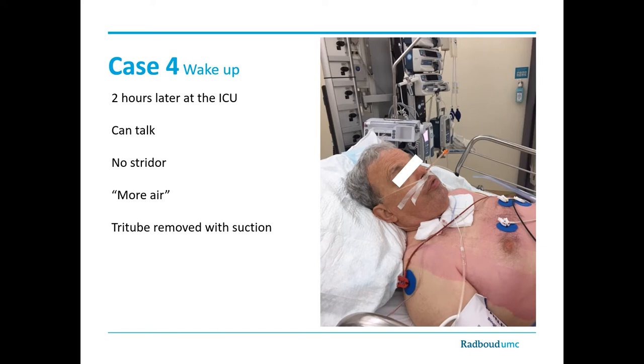Since this patient could breathe quite comfortably with Tritube still in its place, we decided to transfer him to the intensive care unit with Tritube still in place. Of course, swelling can increase the first hours or even day after surgery. So we left it in place for 2 hours and then we removed it. The patient already noticed that even with Tritube still in situ, he had more air, actually.